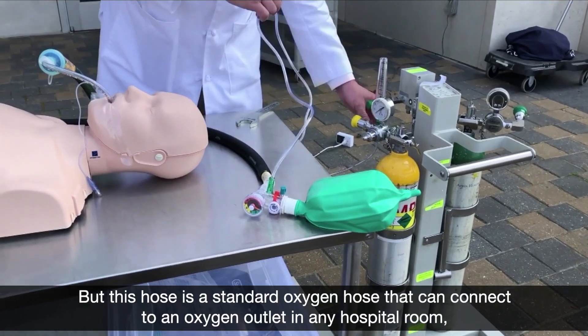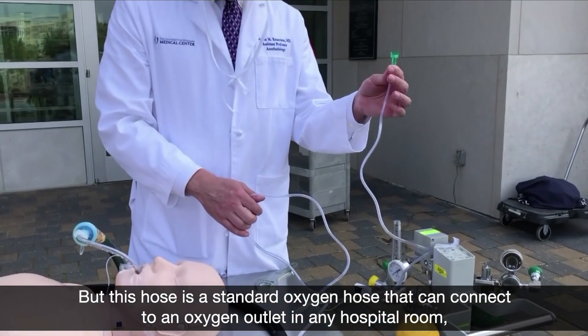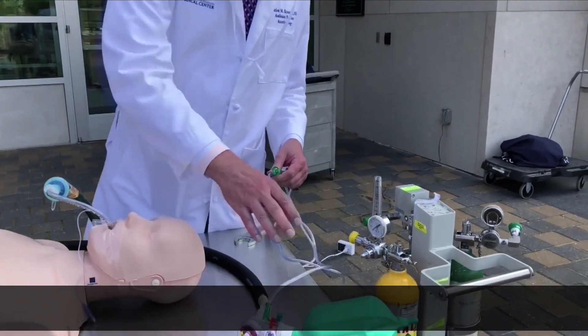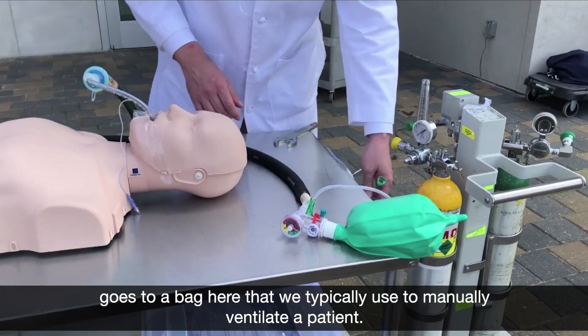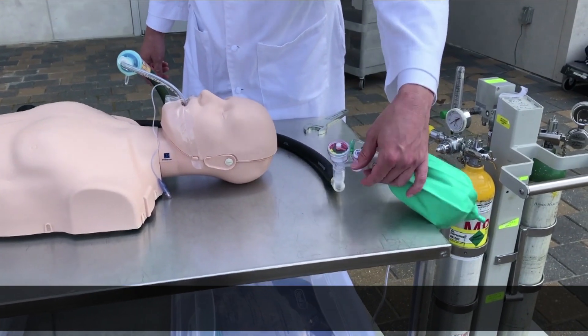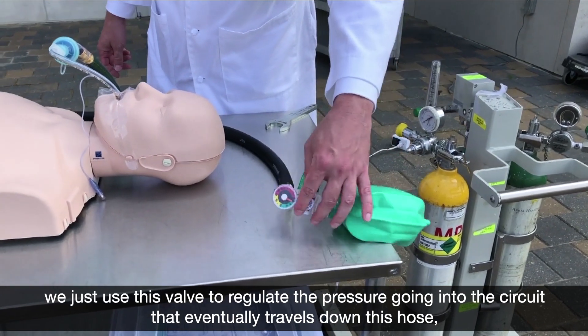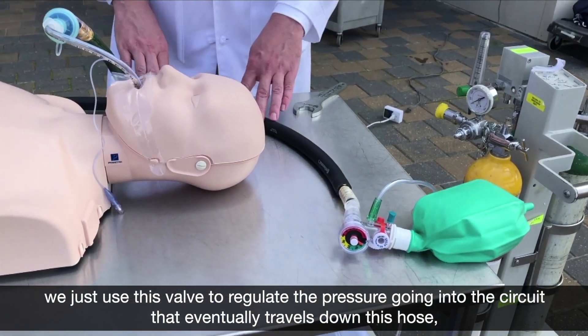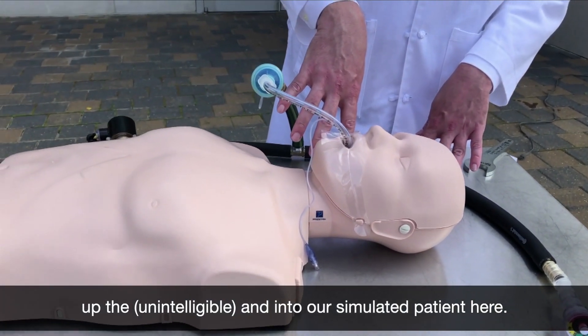This hose is a standard oxygen hose that can connect to an oxygen outlet in any hospital room. It goes to a bag here that we typically use to manually ventilate a patient, but in this case we just use this valve to regulate the pressure going into the circuit that eventually travels down this hose, up the T, and into our simulated patient here.